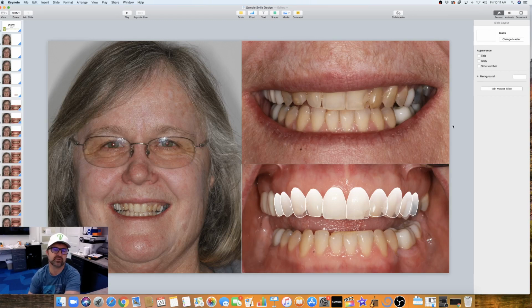Ultimately, the treatment plan needs to be done by us as doctors. There are labs out there that will go through all the steps of getting most of this together for you. There are softwares out there that will do it for you as well or help you. This is a pretty simple, economic way to do it if you want.